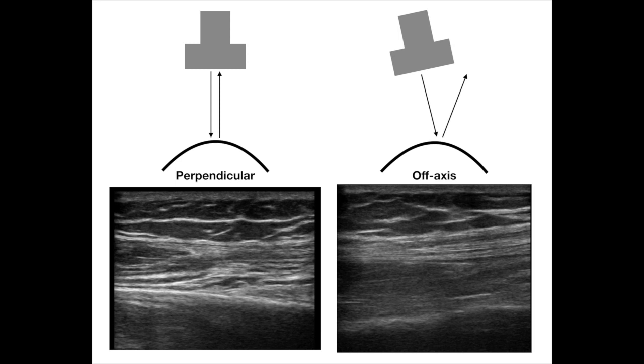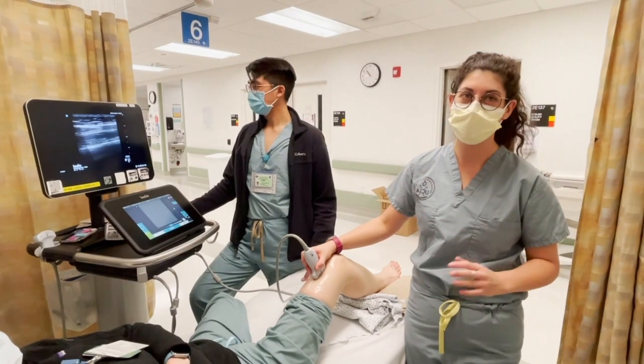If the probe is slightly off-axis so that the ultrasound beam hits the surface in a non-perpendicular fashion, that sound wave will echo off and most of it will not come back to the probe — this is why the image on the right is hazy and less distinct than the image on the left. Now we're going to start sliding the probe down the thigh towards the knee.